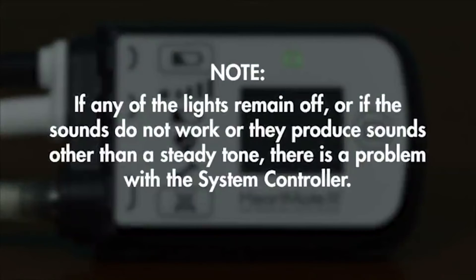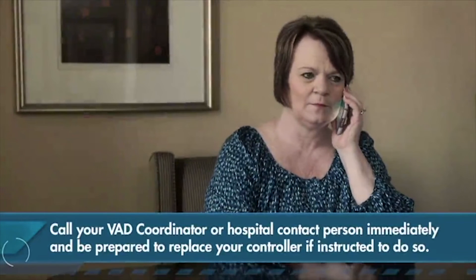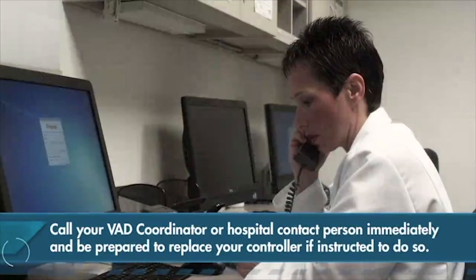If any of the lights remain off, or if the sounds do not work, or they produce sounds other than a steady tone, there is a problem with the system controller. You should call your VAD coordinator or hospital contact person immediately and be prepared to replace your controller if instructed to do so.